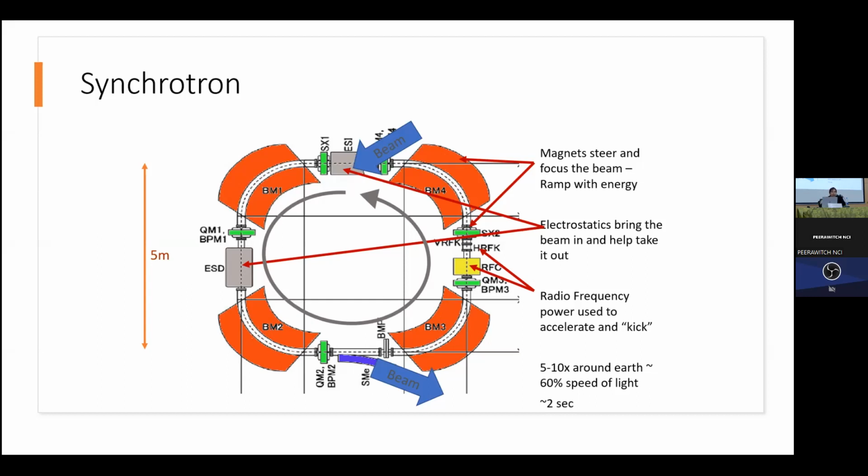So understanding that whole process and seeing how efficient it is depends on how the extraction is done. If you have a multi-energy system and you extract poorly, not in the cleanest way possible, it messes up the beam. Then it's very inefficient to go down to the next energy layer. You'll end up losing a lot of the beam. So you need to take all of that into account to get a very efficient treatment, which is very crucial, as was mentioned.